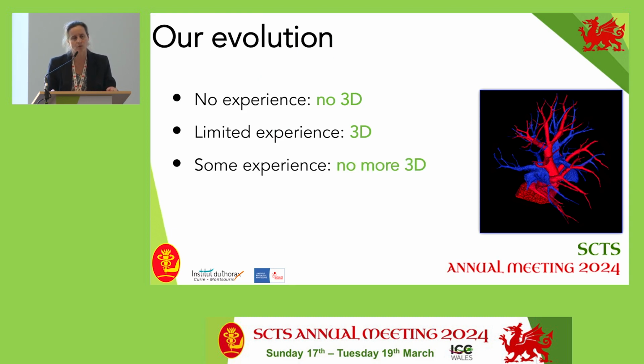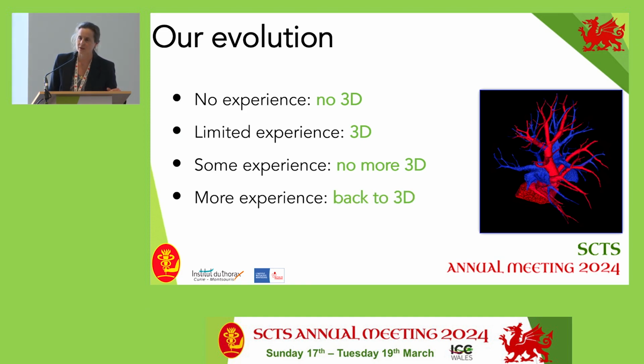And after we felt that we were the best, we have the experience, we know the anatomy, even at the segmental level, and said, okay, no more 3D reconstructions. Everything is okay, but not. Everything was not okay. We were in trouble inside the operating room. So at that time, we said, okay, we get more experience, and we came back to 3D models. And at that time, we said, okay, it's time-consuming. We need it. So let's do it with someone who will send us a very reliable model that we can use during the operation.